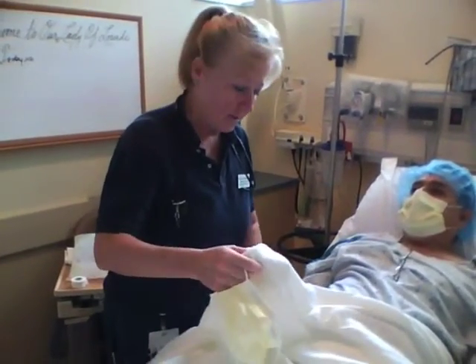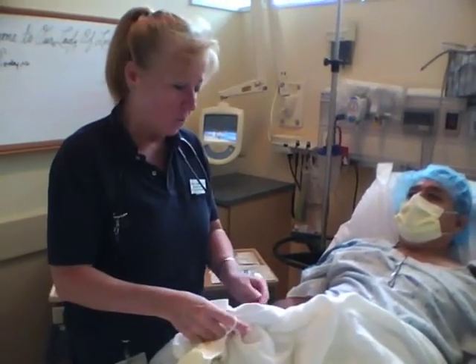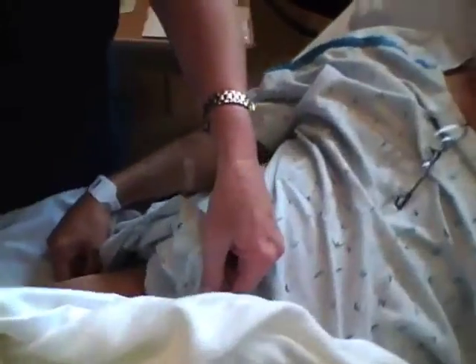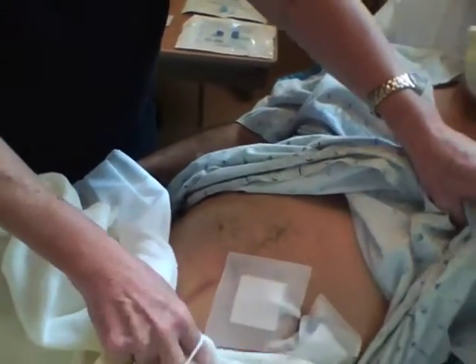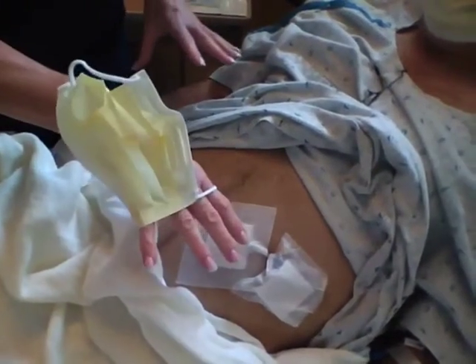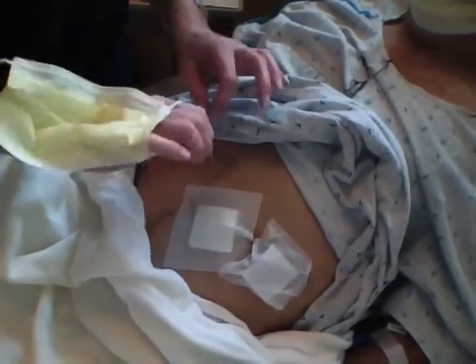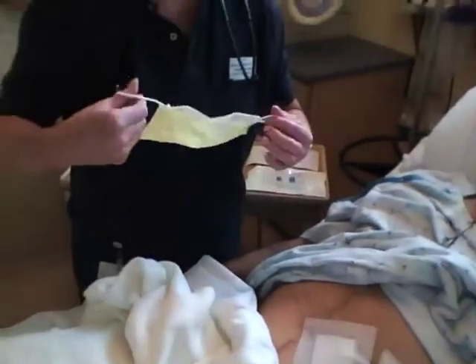What we're going to do is a peritoneal dialysis exchange. This patient is a Lourdes patient which uses Fresenius as an outpatient. They use Fresenius equipment, but when they come into the hospital we use Baxter equipment. So the Fresenius tubing Tenckhoff tubing adapter has to be changed, and then we can do the exchange.